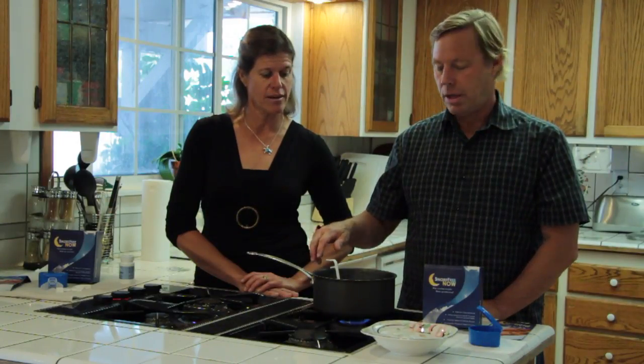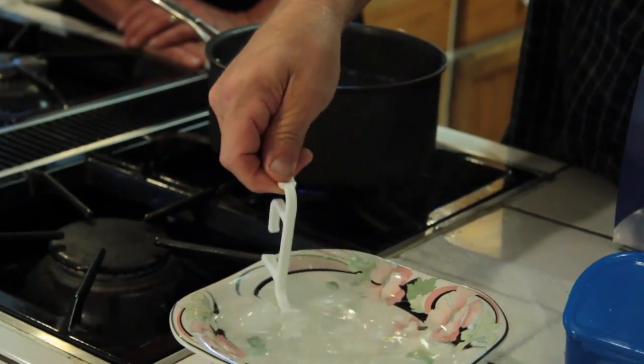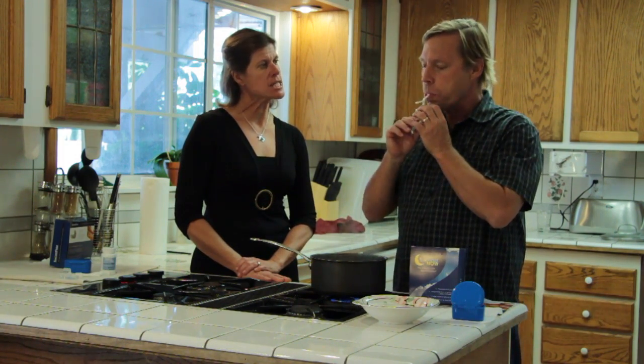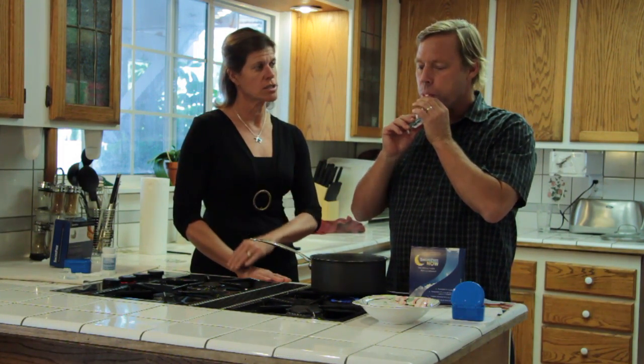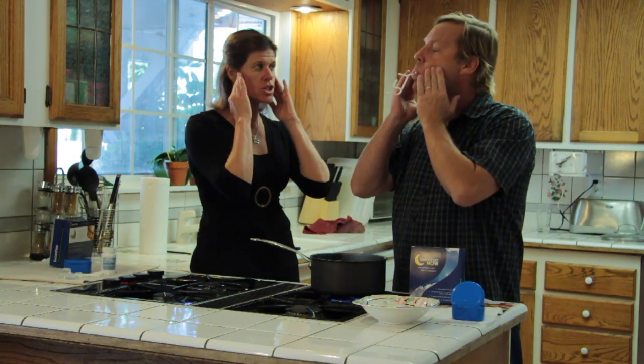Okay. So, are we about there? It is time. Perfect. We took it out, and 1,000, 2, 1,000, and 3, 1,000. Alrighty, so you're going to push your tongue forward, your jaw forward. Okay, perfect. And then I'd like you to kind of just press on your jaw.